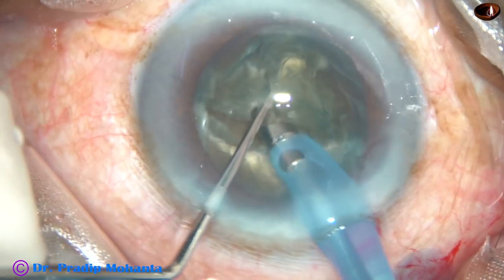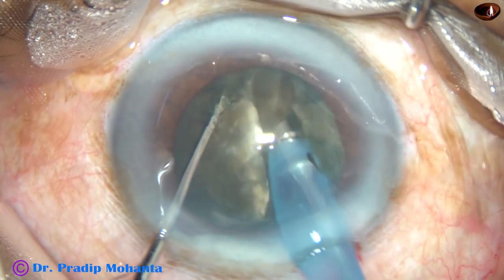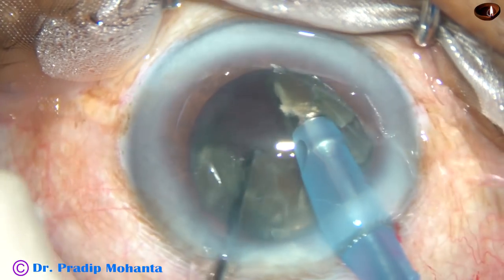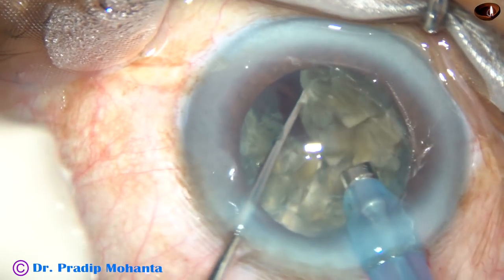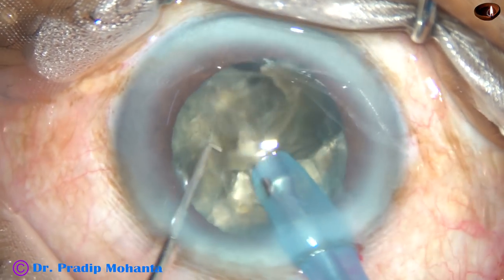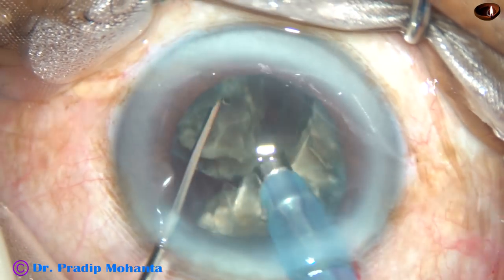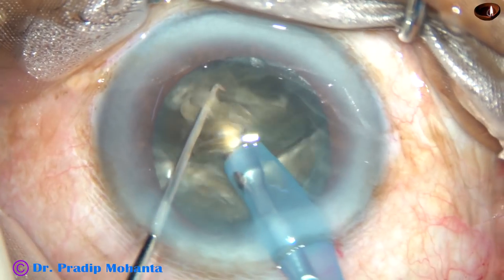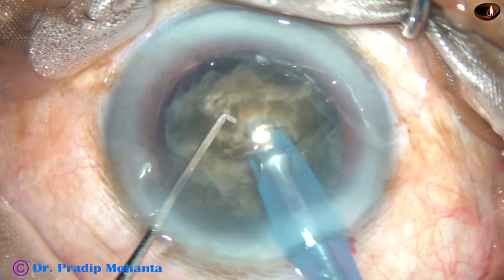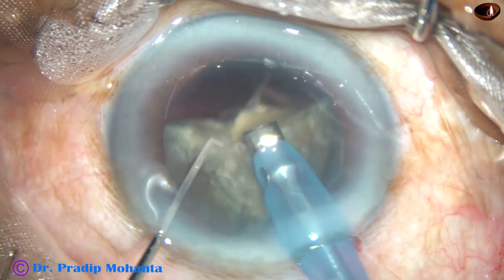Friends, if you don't have access to a femtolaser which can soften this kind of hard nucleus, don't be afraid. Just increase your skills and conquer these cases very comfortably. Each nuclear piece is tilted so that you can start emulsifying from its apex. Phaco power used in this case is 85%, flow rate is 45 ml per minute, and vacuum is 450 millimeters of mercury.